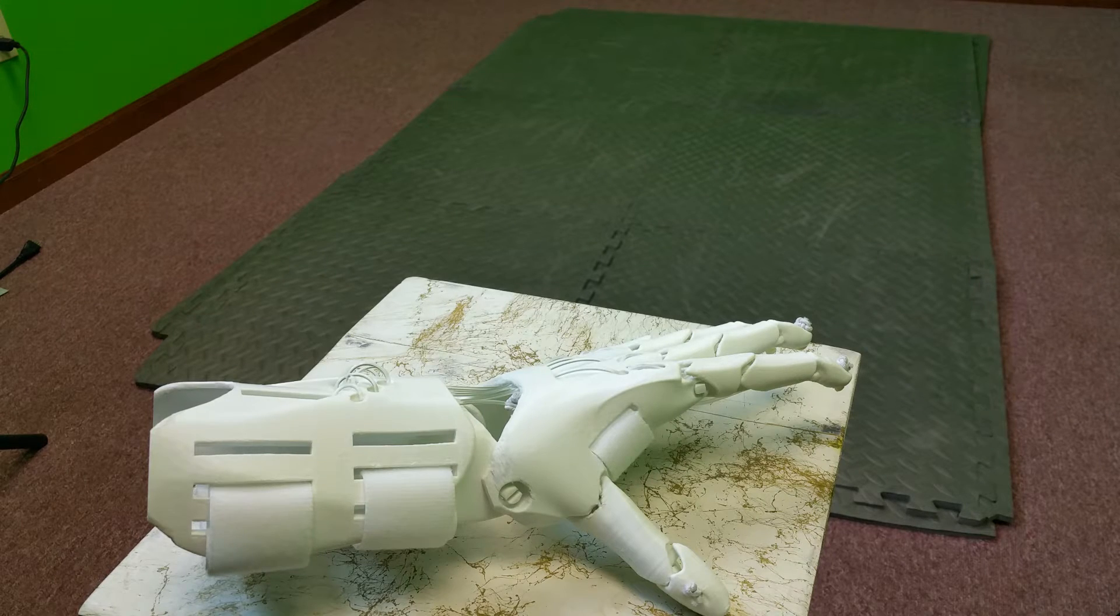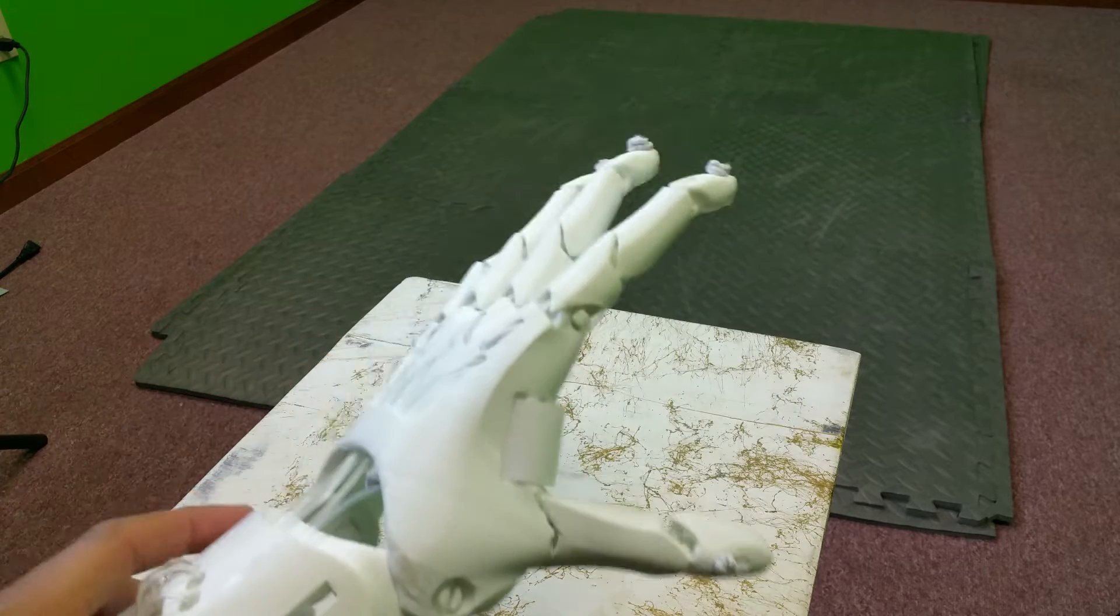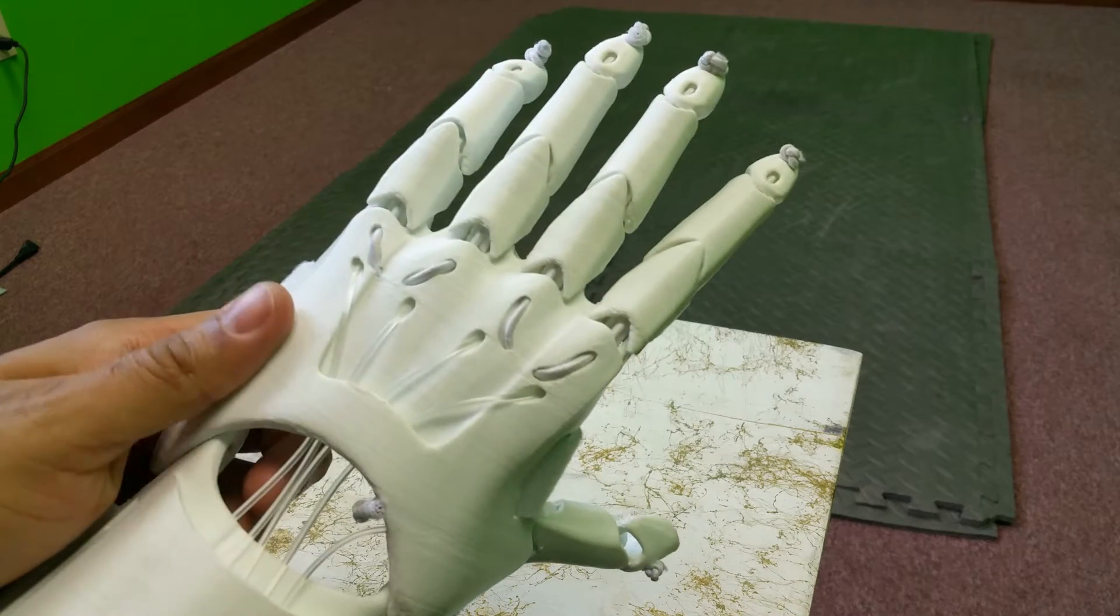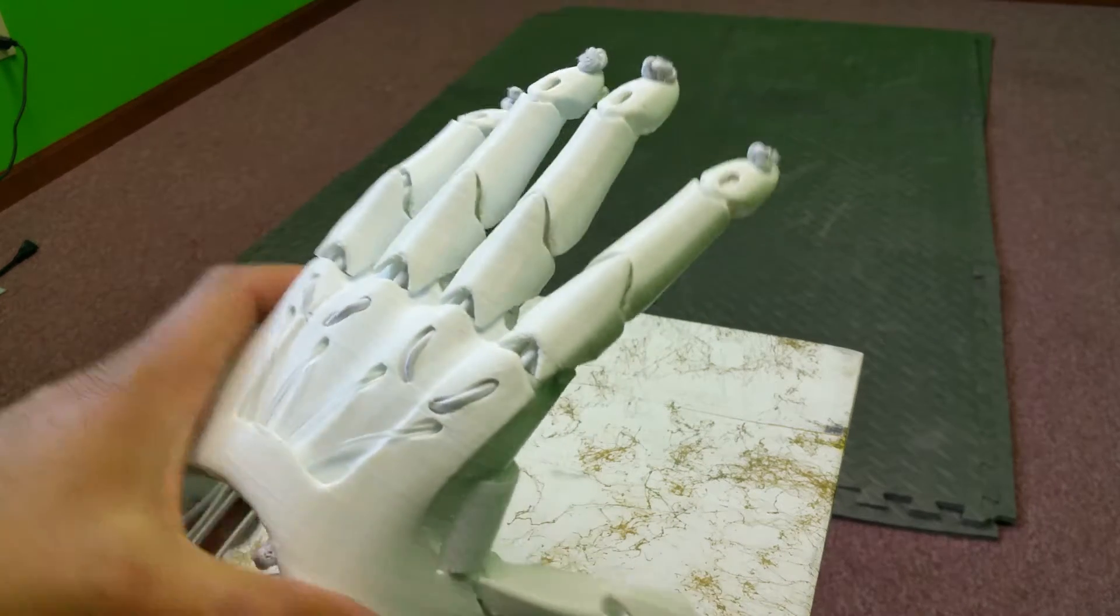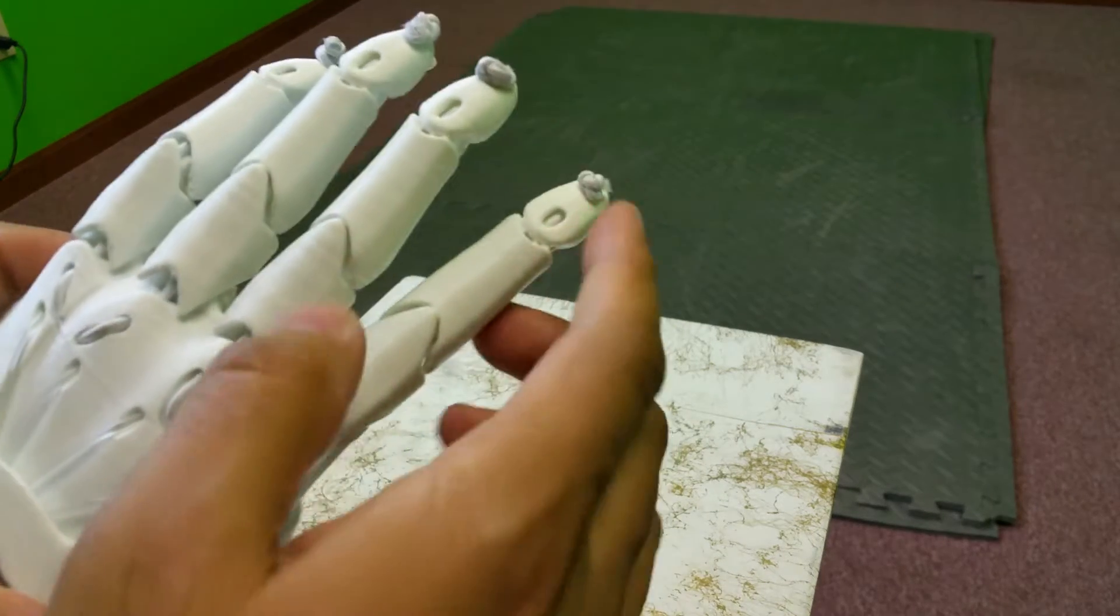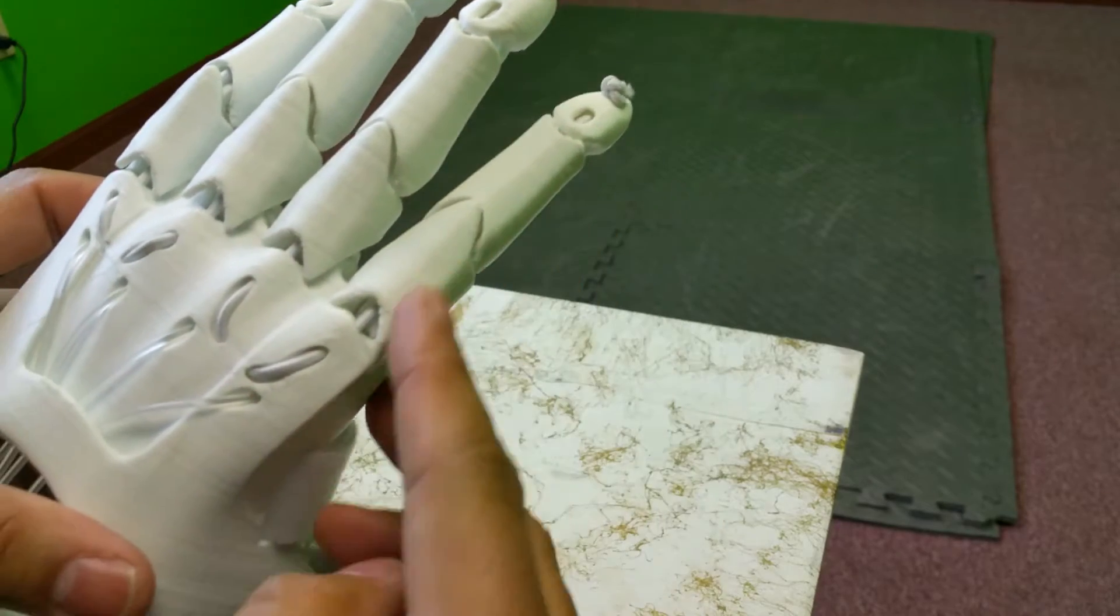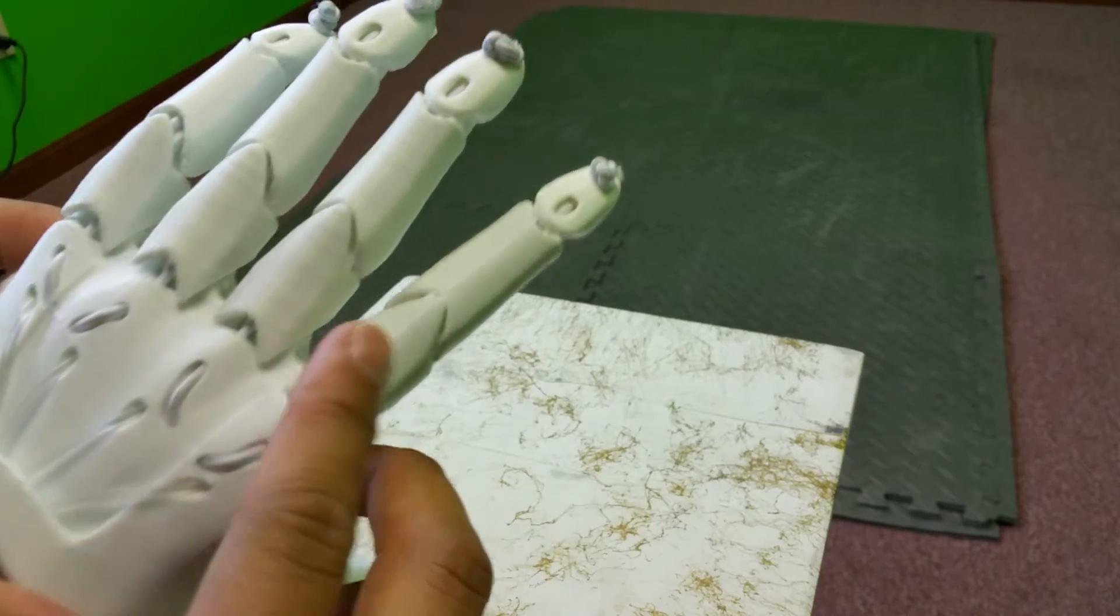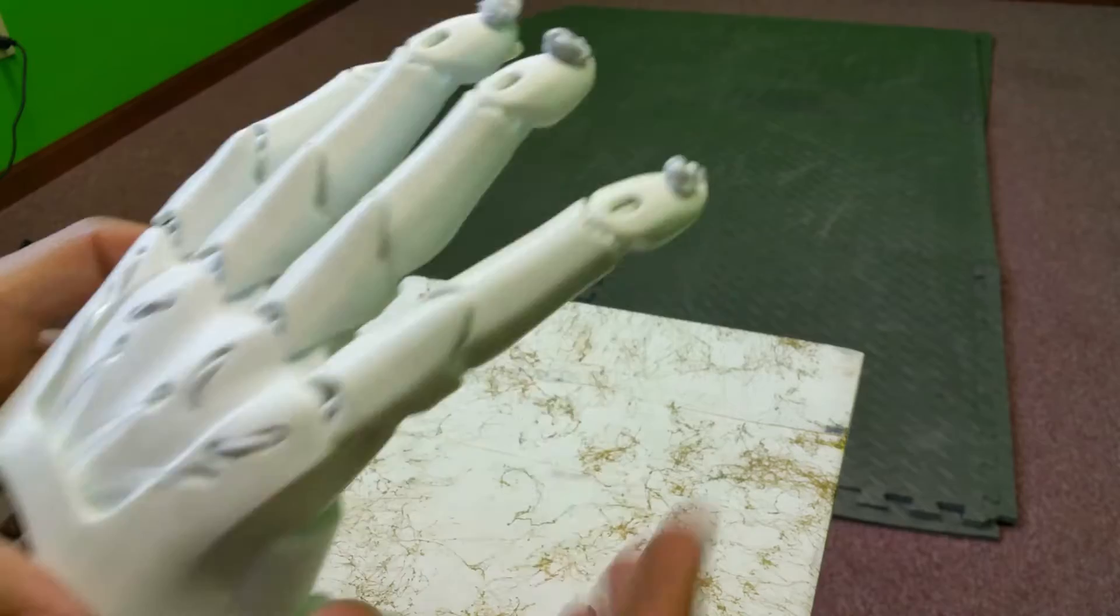Okay, I have a fully assembled K1 hand here. This is printed in white PLA. There is the normal elastic. We just used white elastic bands here to keep the spring tension.